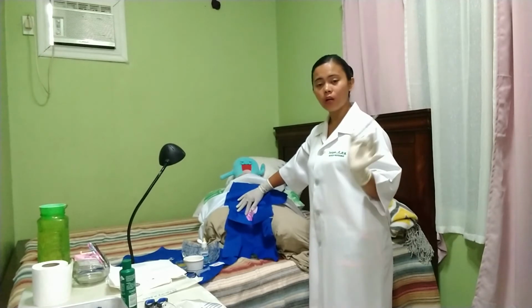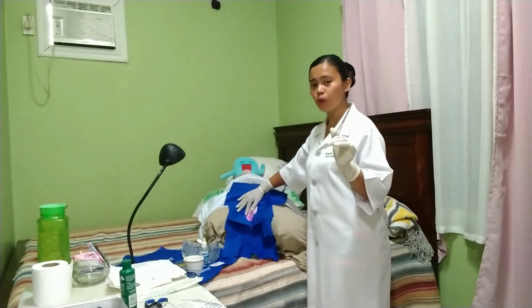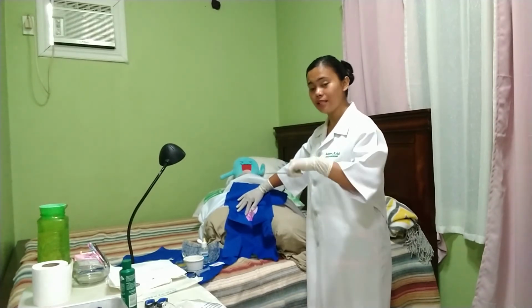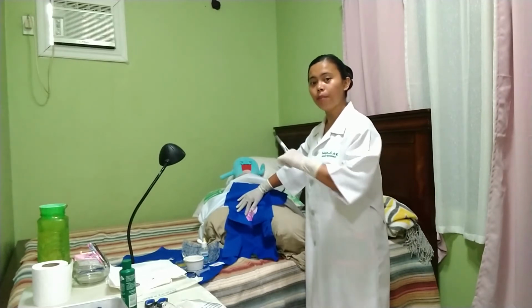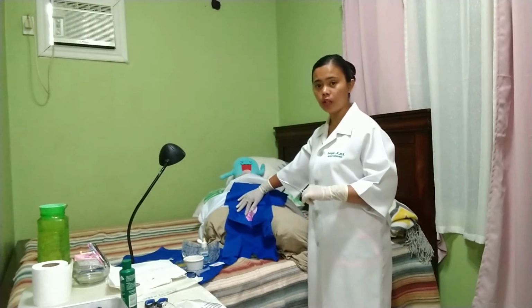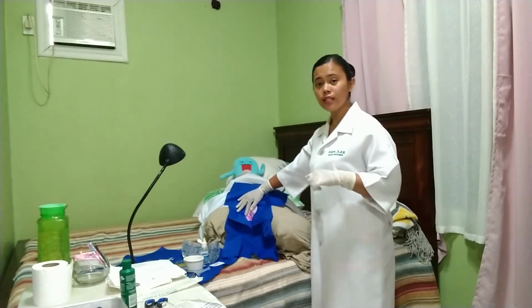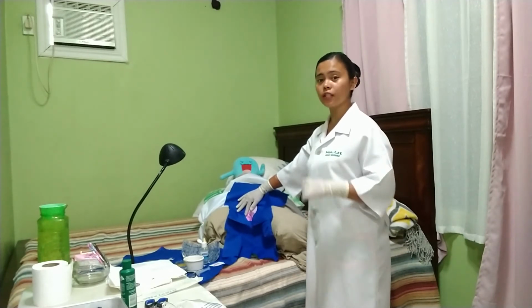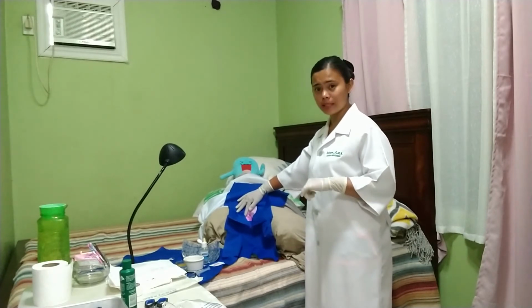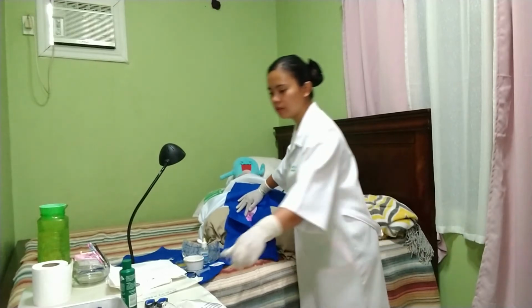In the same way, using our dominant hand for male clients, grab the forceps and a cotton ball, and clean the urinary meatus from inside to outside and partially down the shaft. We have to repeat that for at least 2 more cotton balls. We have to remember, do not contaminate our sterile field. Using the circular motion from inside to outside is actually abiding the clean to dirty principle. Next thing to do is to discard the forceps away from the sterile field.